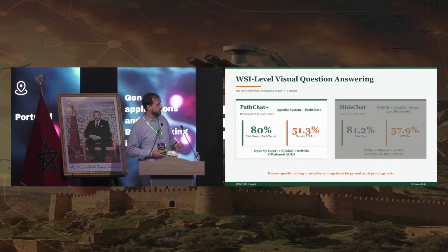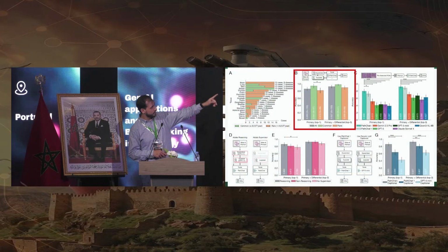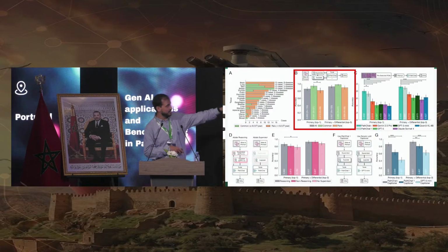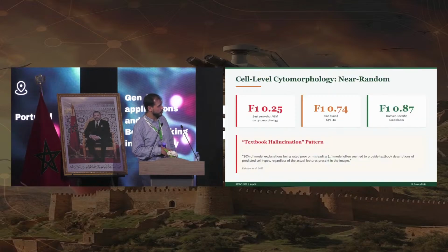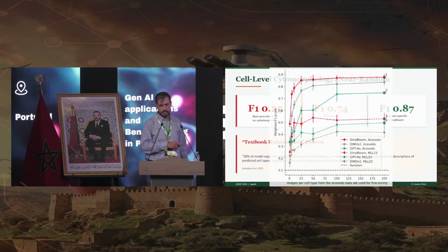And you can see that this is quite a big difference. And if you want to look at what is the performance with the whole slide, you can see it's here. I can point it, but it's 86% correct in the overall data set and 94.1% accurate in the more common lesions.